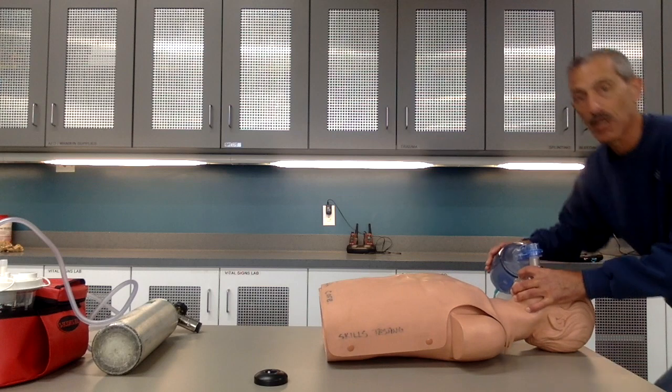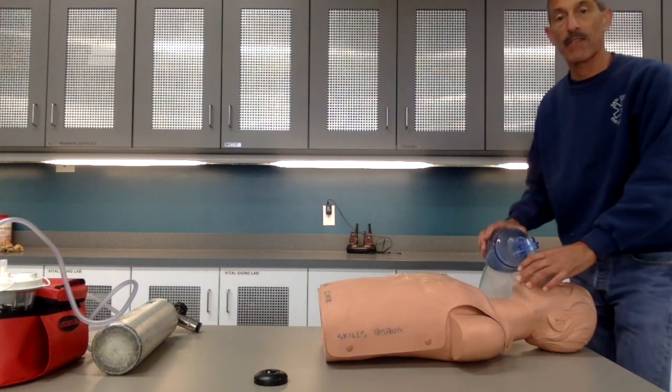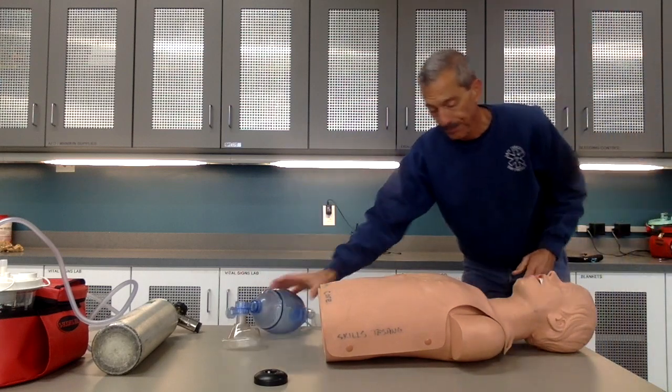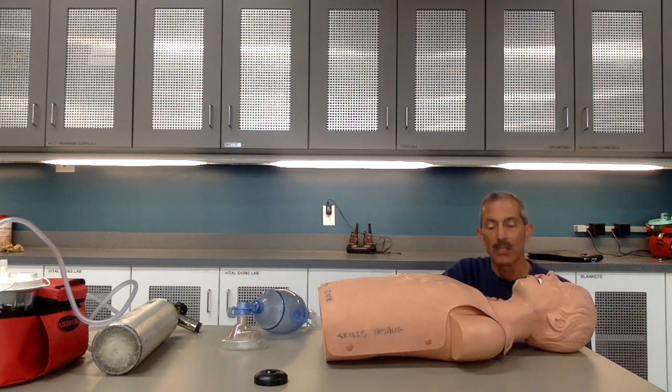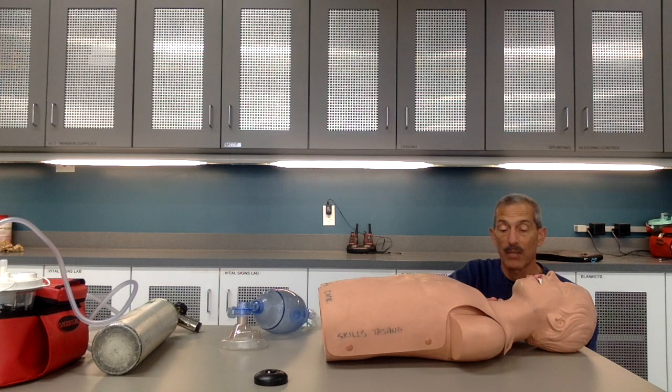At some point the proctor will say that my ventilations are going in effectively. I'm going to stop. I'm going to recheck a pulse for up to ten seconds and breathing. One one thousand, two one thousand, three one thousand, four one thousand, five one thousand. The patient still has a pulse, still is not breathing.